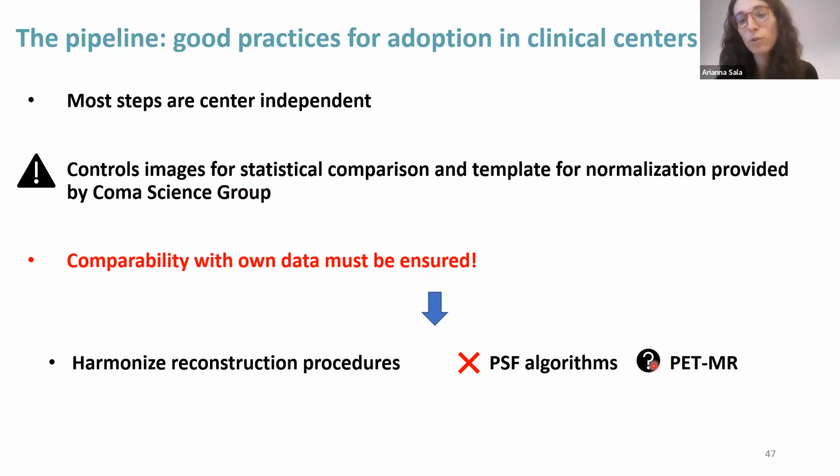And it is a bit more tricky to use images derived from a PET MRI scanner, as our images were derived from a PET CT scanner. But it's not impossible, all depends on the reconstruction procedures that are used.